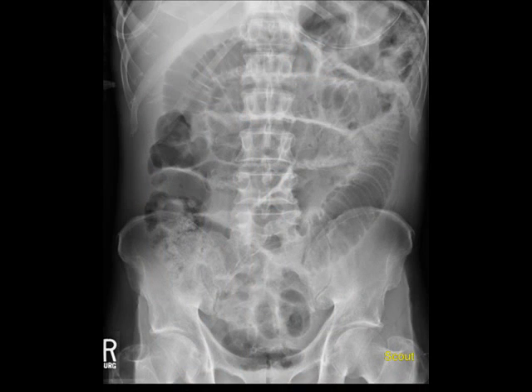After getting the patient on the table, the first image to be taken is called the scout image. This is done before any contrast is administered. That gives a baseline for the study and allows the radiologist to see if the prep kit worked well enough.